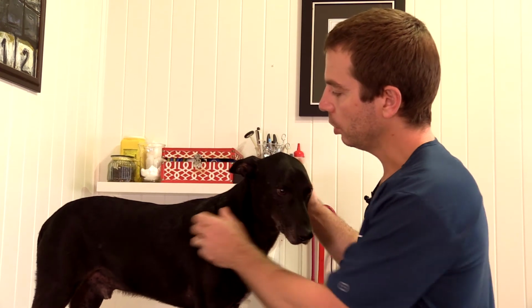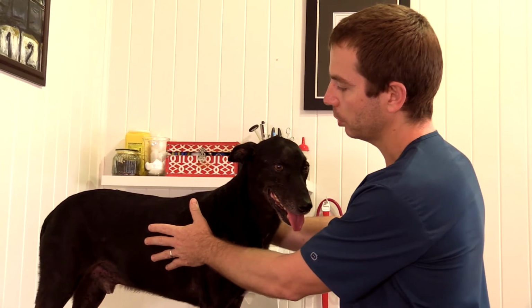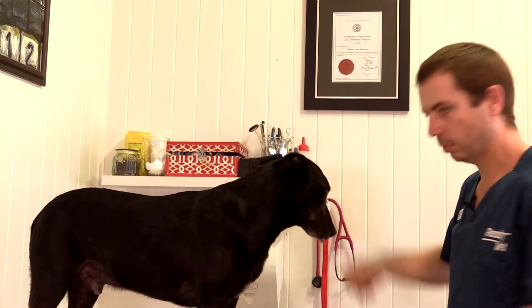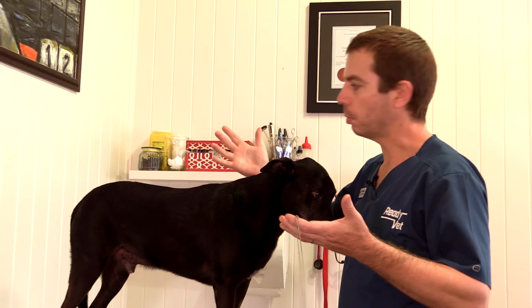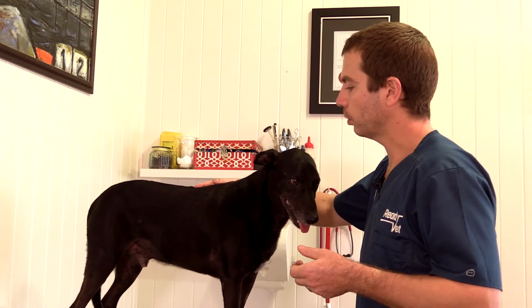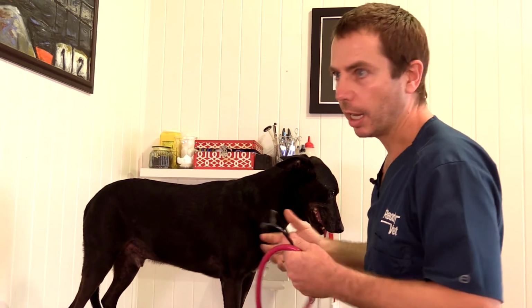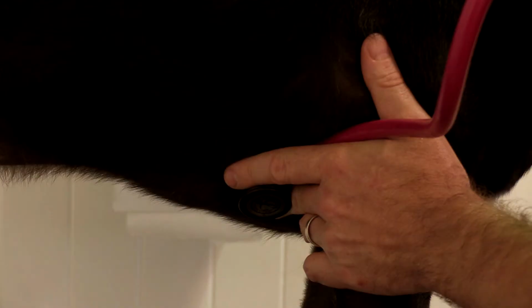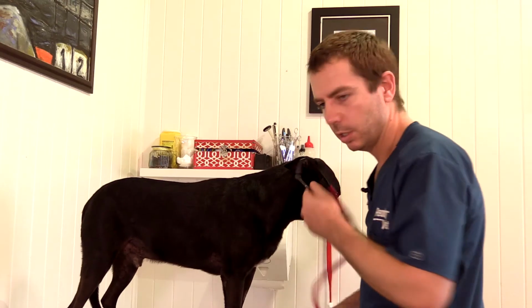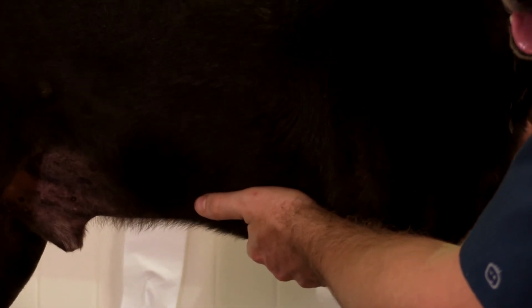But otherwise, you can just either hold, or in a hairy dog that might be easier, and count. So 1, 2, 3, 4, 5, 6, 7, 8, and you do that as you're holding a watch, and get up to 15 seconds, multiply the number by 4, or 30 seconds, multiply by 2, it's probably slightly more accurate, and then move on to heart rate. So I would typically assess the heart rate and also listen to the heart sounds with a stethoscope. If you haven't got a stethoscope at home, not many people do, then you can. Some dogs you can actually feel the heartbeat like this, but he's panting, so it's a bit difficult.